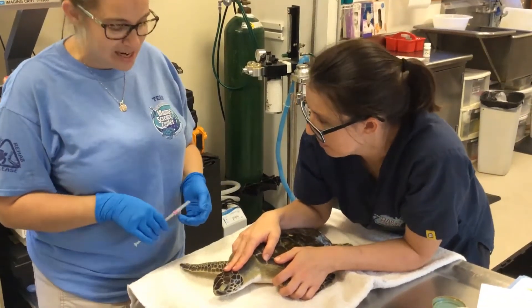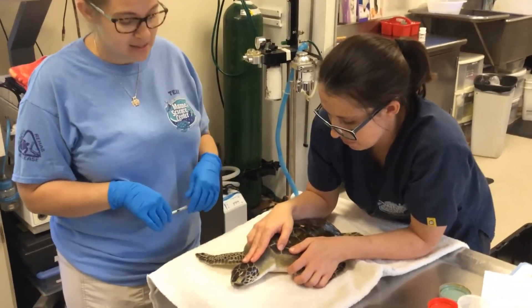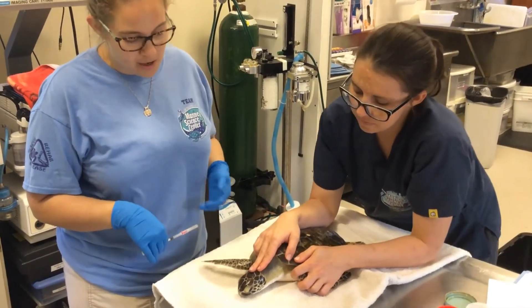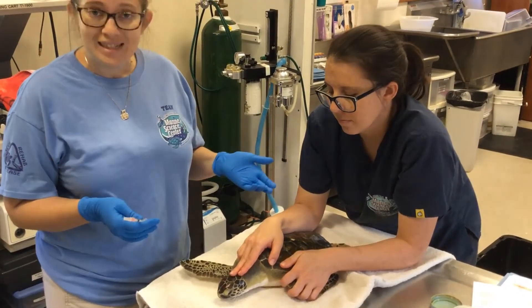We are getting ready to tag Zucco. Zucco is a juvenile green sea turtle that came to us in February of this year, February 22nd, and came in lethargic, a little underweight, dehydrated, and we're getting ready to tag Zucco for release.